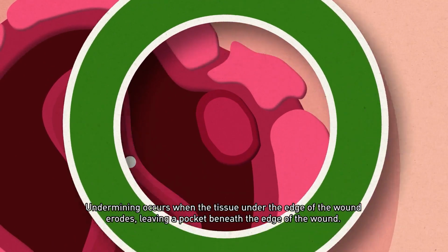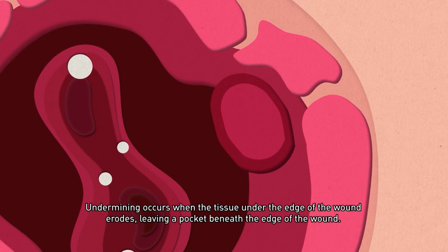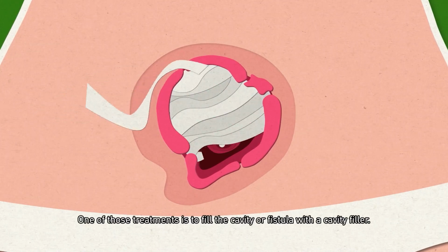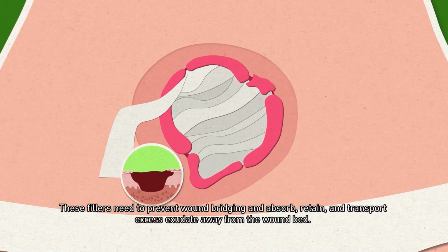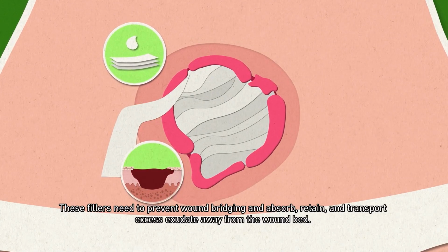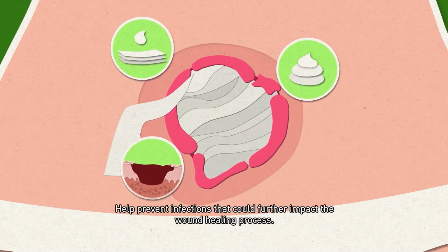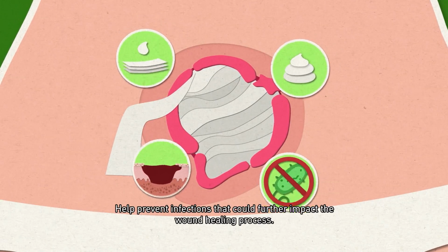Undermining occurs when the tissue under the edge of the wound erodes, leaving a pocket beneath the edge of the wound. A cavity or fistula needs to be managed carefully. One of those treatments is to fill the cavity or fistula with a cavity filler. These fillers need to prevent wound bridging and absorb, retain, and transport excess exudate away from the wound bed. Keep the wound moist and help prevent infections that could further impact the wound healing process.